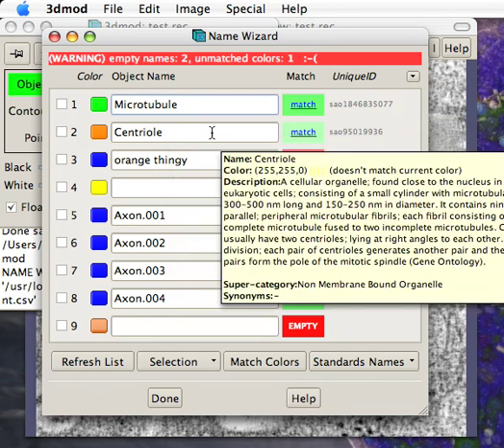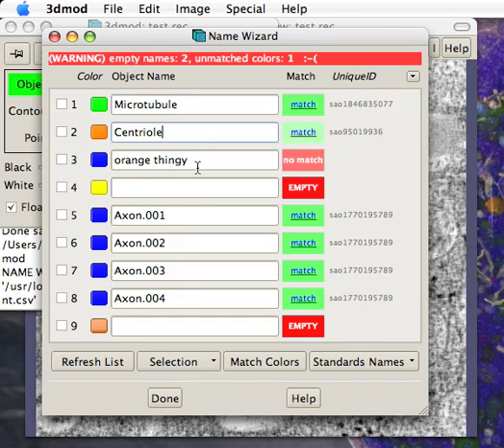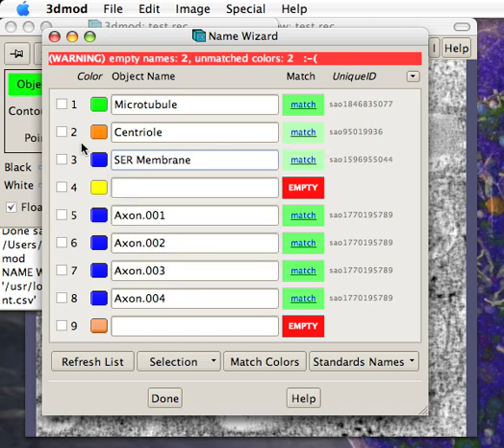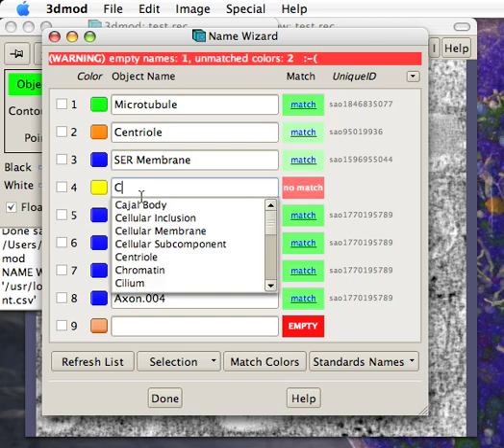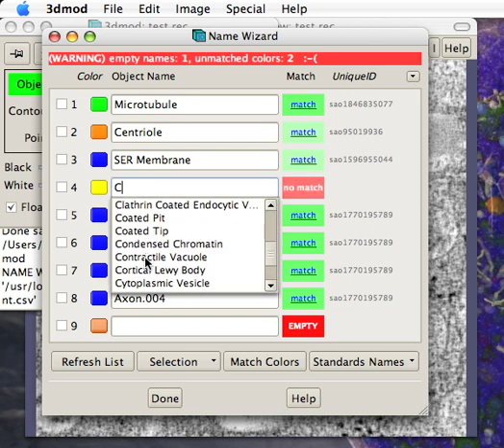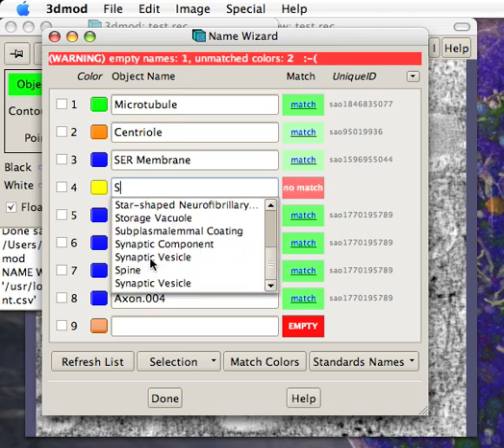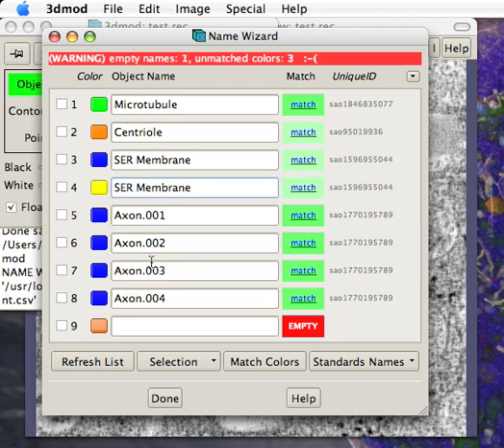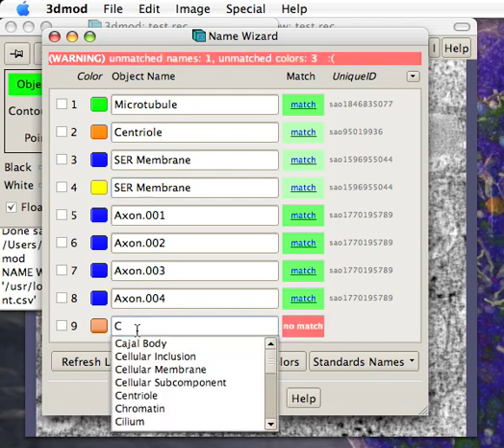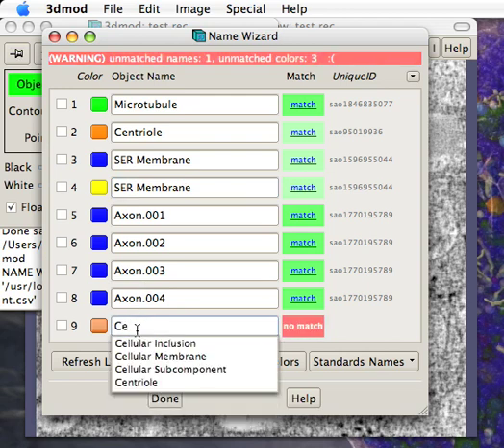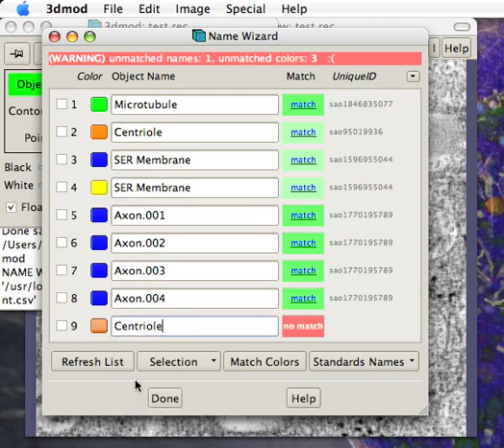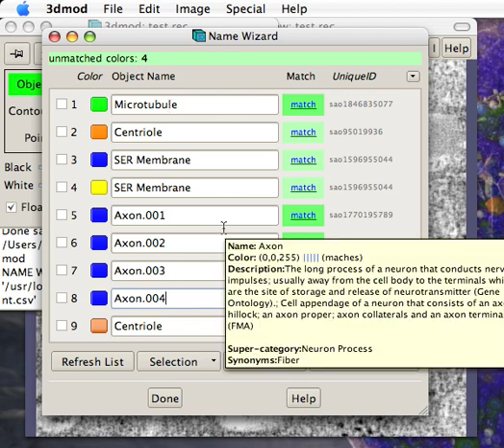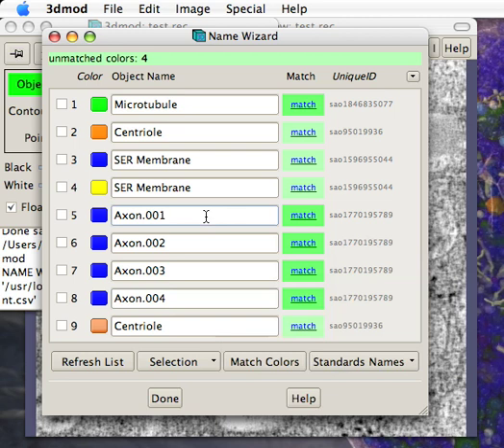The power of this is it lets us quickly change names. Here I'm just going to start typing and you can see autocomplete. Let's name this the SER membrane. Here I'll make another centriole object. You see this thing's turned green. So interactively it shows us what matches to proper names.